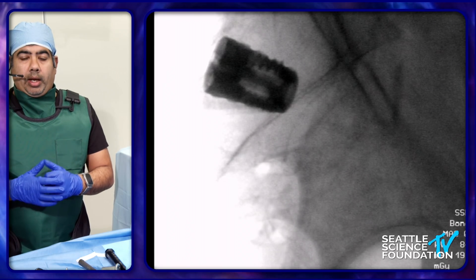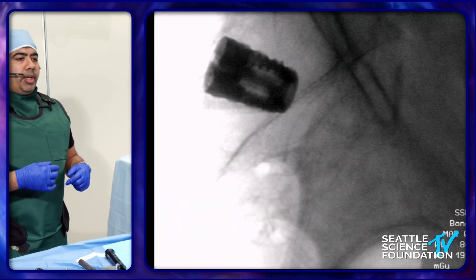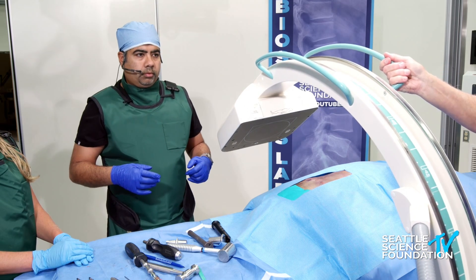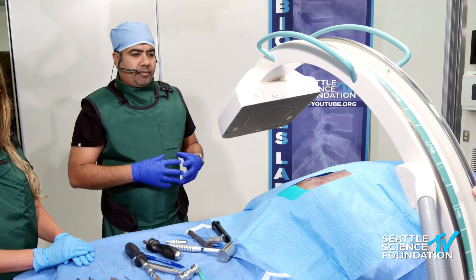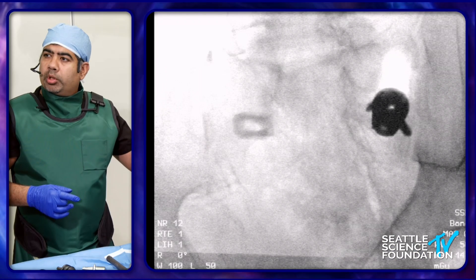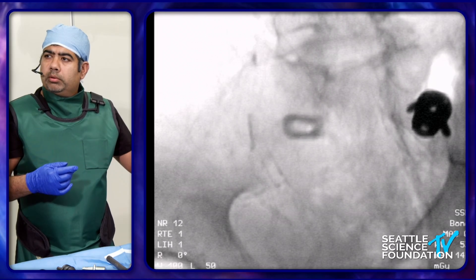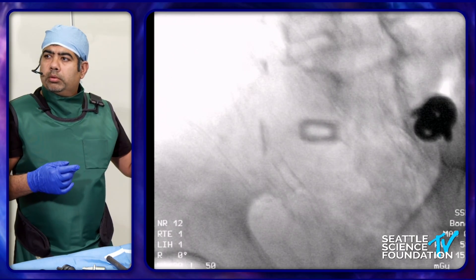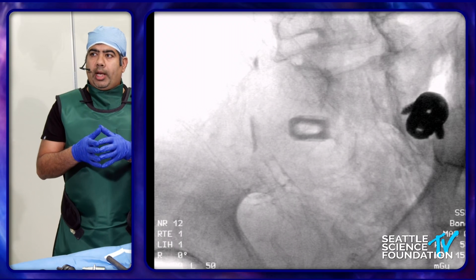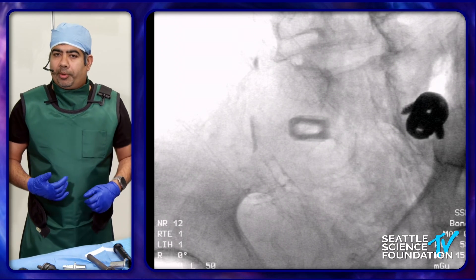My final X-ray, which I'll upload in my EMR for the patient's history and notes, will be on the contralateral oblique — about 20 to 22 degrees. I'm seeing both screws across the SI joint, and the barrel filled with bone graft is right in that SI joint line. That's your transfixation device. With that, I'm going to pass it on to Dr. Beal, who will carry on with the other two approaches. Thank you.